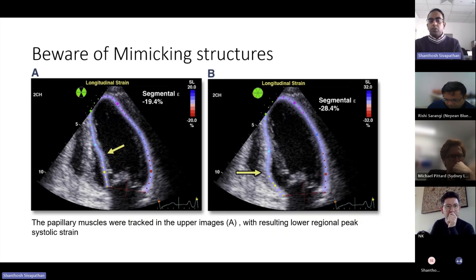The reason why I'm mentioning all of this is that knowing what the pitfalls and errors can be, you can go back and say, okay, hang on, where did I stuff up in my analysis? Or if someone else has done it and you want to double check, you can say, yeah, they've done it correctly. That's a good reflection.